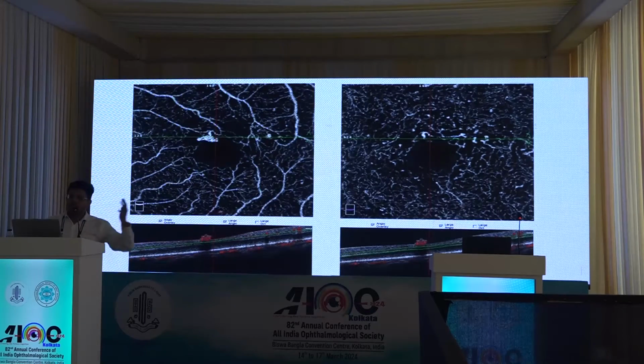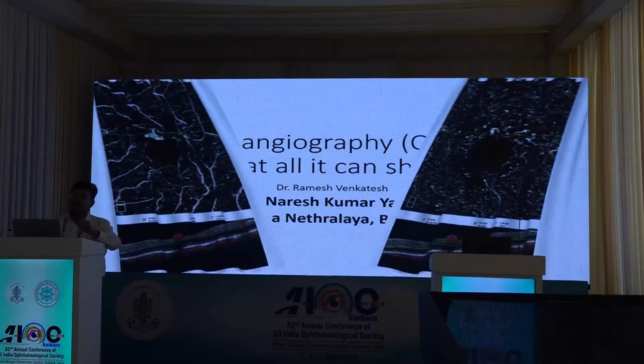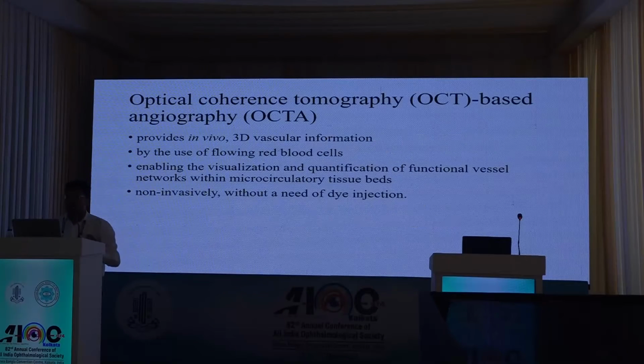So with this basic information, I'll be talking about OCT angiography, and I'll be substituting Dr. Naresh Yadav, who was not able to come for this meeting.